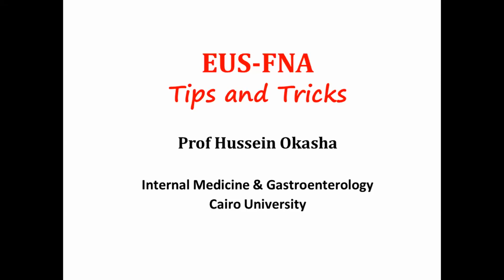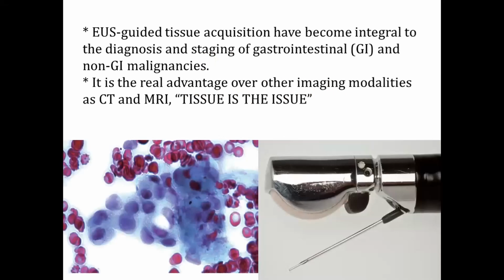I will start with my lecture. It is about 25 minutes, about endoscopic ultrasound tissue acquisition or tissue samples. And in this lecture, I will try to spotlight some of the tips and tricks regarding this technique. Actually, EUS-guided tissue acquisition has become integral to the diagnosis and staging of gastrointestinal and non-gastrointestinal malignancy, and it is the real advantage over other imaging modalities such as CT and MRI, because in most instances, tissue is the issue.